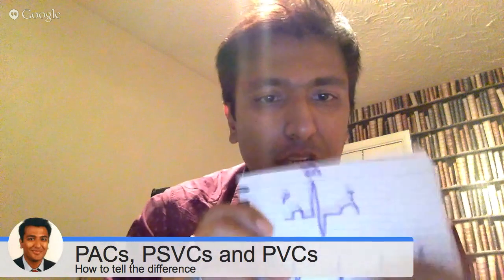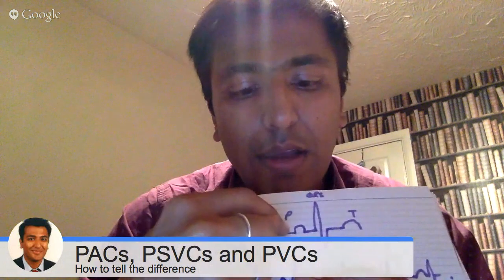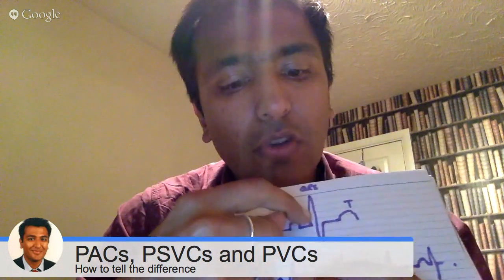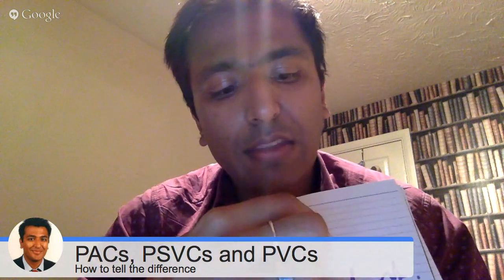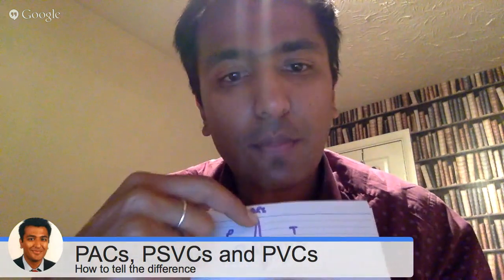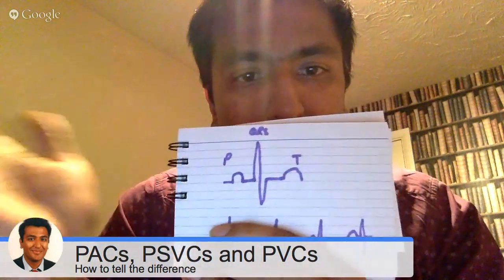Okay. Now, if you look at the ECG when that happens, this is what happens. When the guy beats the drum, the first thing is that there is the noise that goes into the atrium there. Then it goes to the ventricles, and then eventually, after coming back from the ventricles, the echo dies down, and at this point, the guy will then start beating the drum again. Okay, so this is what it looks like. This is called a P wave. There's a QRS complex here, and there is a T wave here. Okay, so that's what a normal ECG looks like.